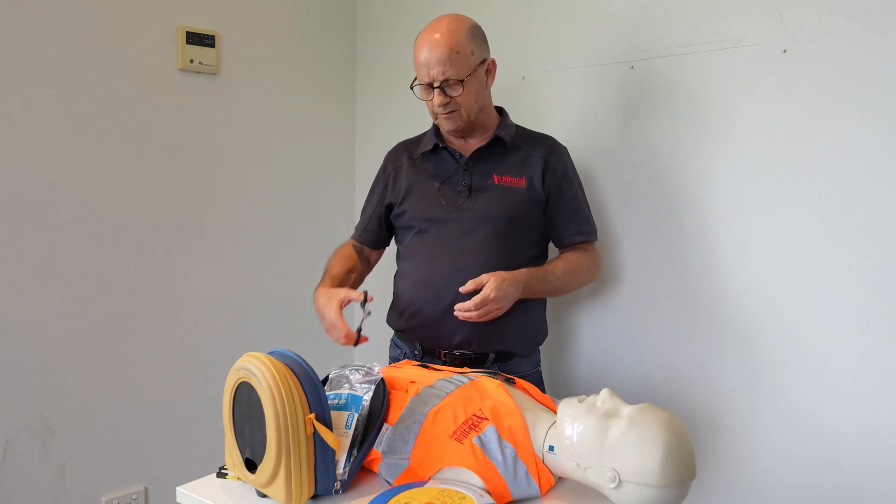Regardless of whether the defibrillator delivers a shock or not, we are encouraged to continue our CPR in time with the defibrillator. 'Begin CPR — it is safe to touch the patient. Place overlapping hands in the middle of the chest, press directly down in time with the metronome, remain calm.' This model will also tell you whether you need to push harder or faster. The defibrillator will have you do two minutes of CPR, then analyze the heart again, continuing that cycle until the patient recovers.